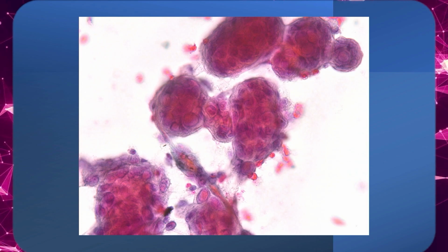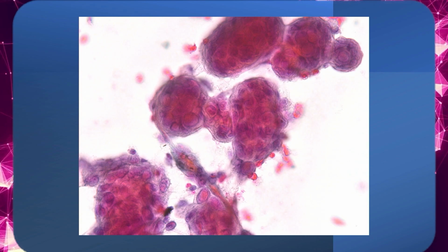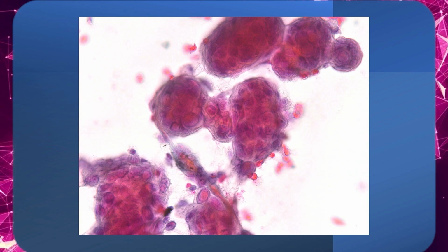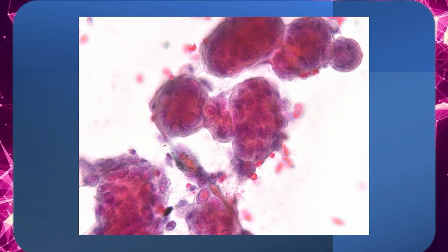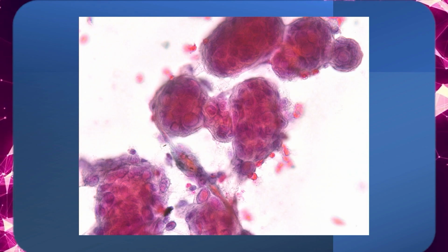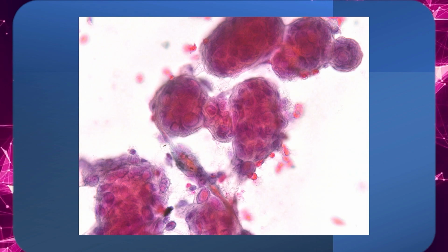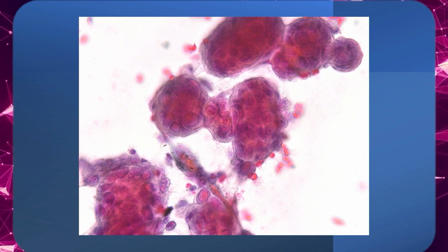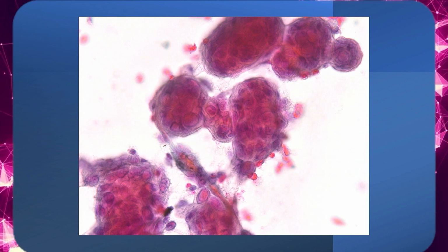You can ask me a question about the history. It's so easy. So what's the question? I'm happy to answer. So you mean neck or thyroid? Thyroid. You want me to answer if there is history of a papillary thyroid carcinoma? No. HSV is a beautiful thought, but how come every nucleus has an HSV change? That is an important thing.